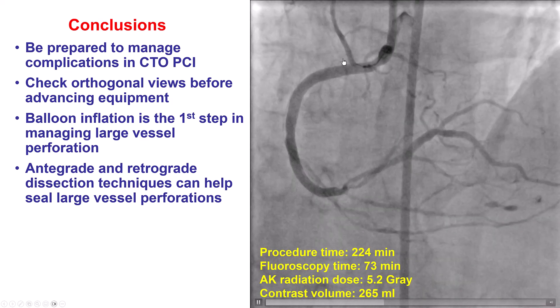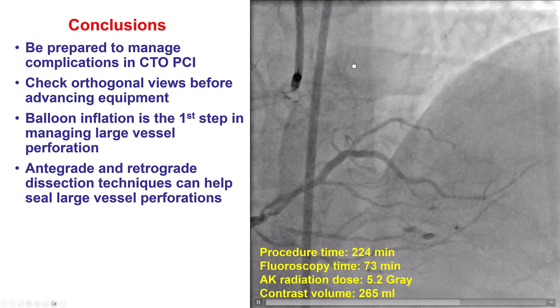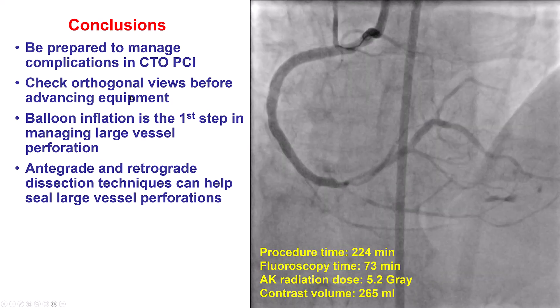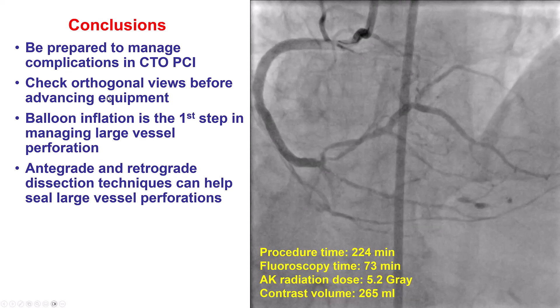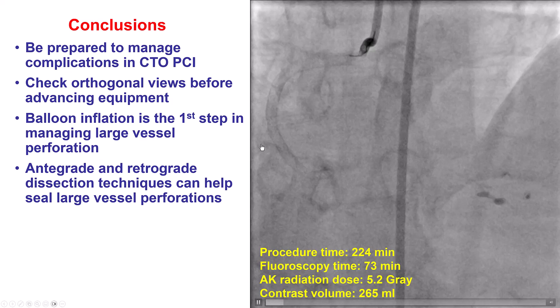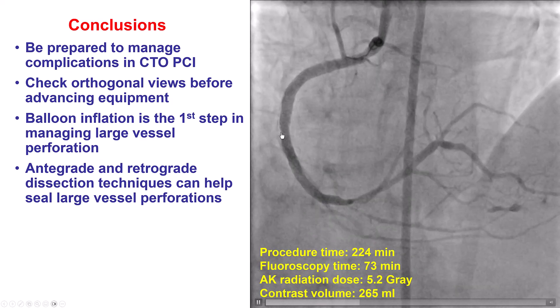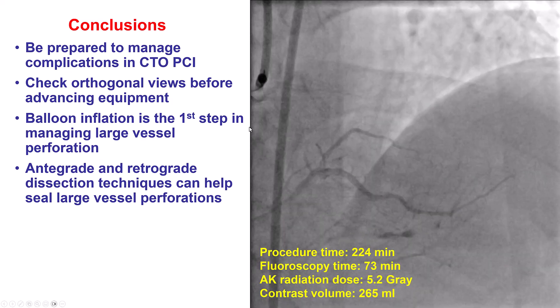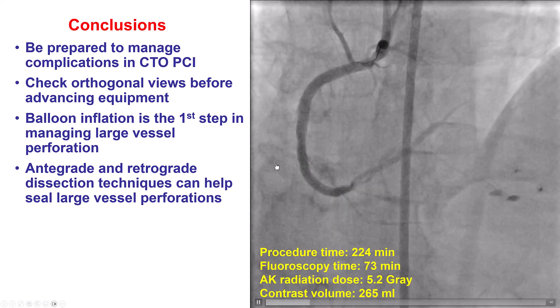There are multiple lessons from this case. First, complications can happen in CTO-PCI. One of the most important ways to prevent a complication is to check equipment position, which can be done using orthogonal views. In this case, we were fooled — we thought the wire was in the right coronary artery, whereas retrospectively it had actually entered the acute marginal branch.